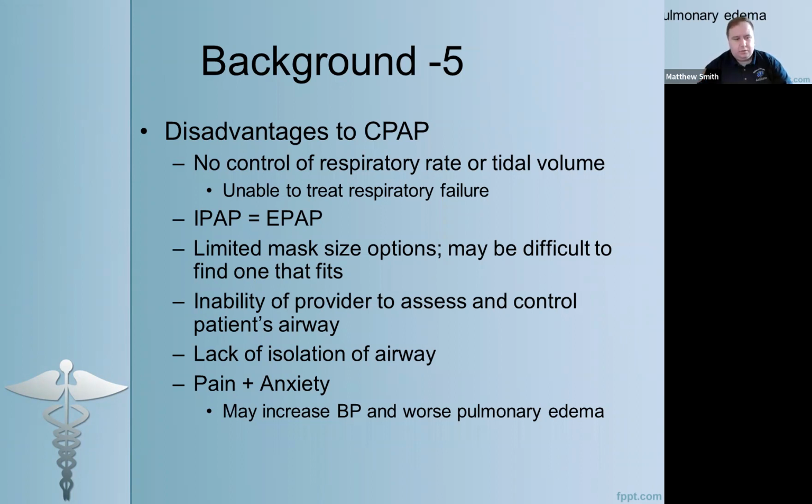So this is not really a disadvantage relative to any BLS treatment modalities, but if you had paramedics that might be treating this patient, the paramedics could perform endotracheal intubation, right? And so endotracheal intubation isolates the airway, it protects it. Even if the patient is vomiting, the vomit can't get into the lungs. That is not the case with CPAP. And so you do have to be very cognizant of the risk of aspiration of vomit or blood, or anything else that might be in the patient's airway.